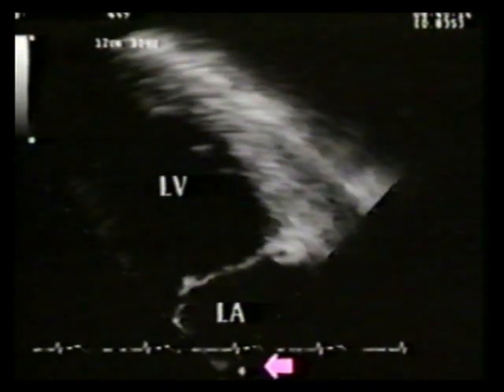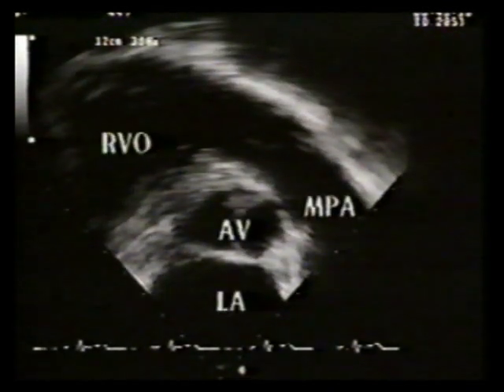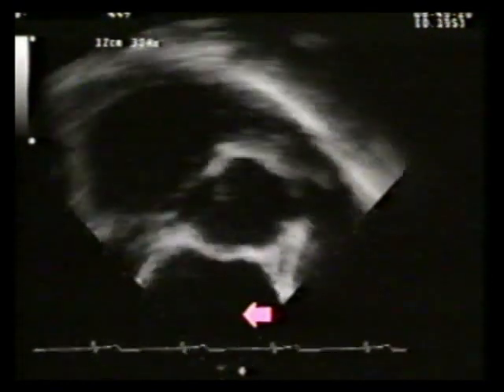The next sequence illustrates these longitudinal views. First is the left atrial view, in which left atrium is posterior, mitral valve, and left ventricle. The next view is the right ventricular outflow view, with the right ventricular outflow anteriorly cut in long axis, the main pulmonary artery, an oblique section of the left ventricular outflow tract.